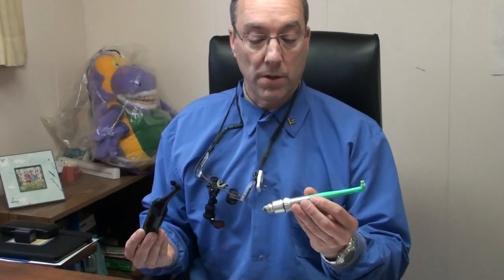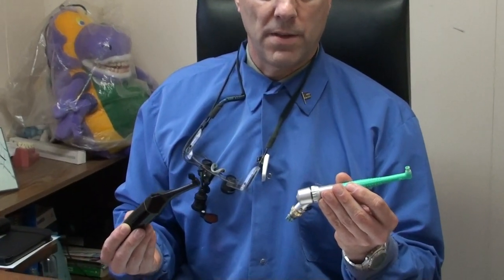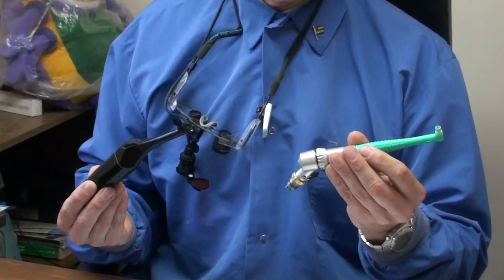This is the Rotodent. And as you can see, it's designed very similar to the instrument that your hygienist cleans your teeth with.